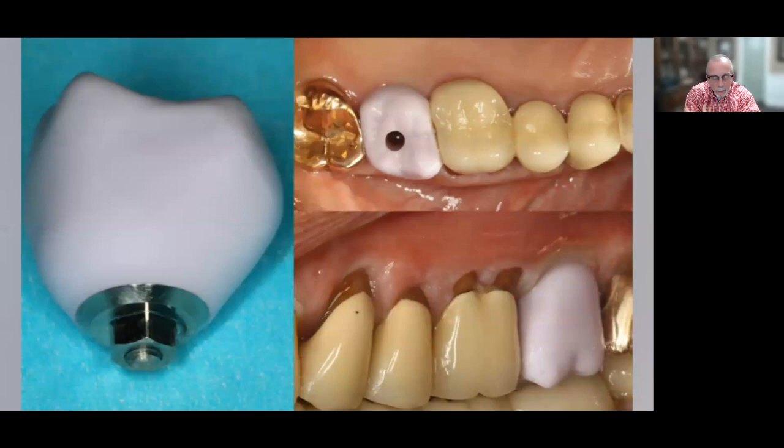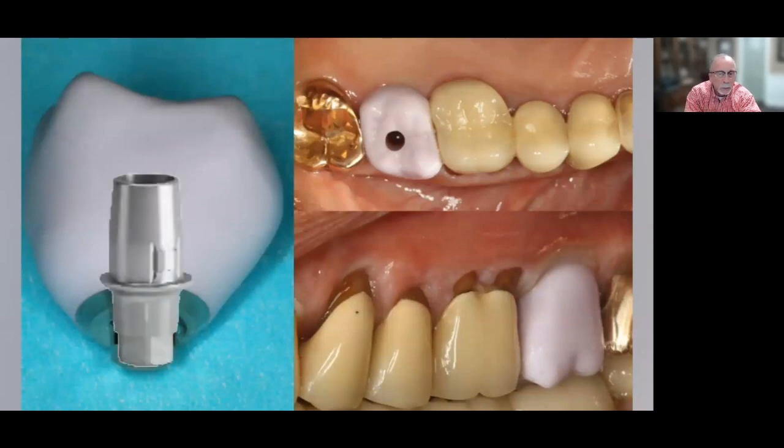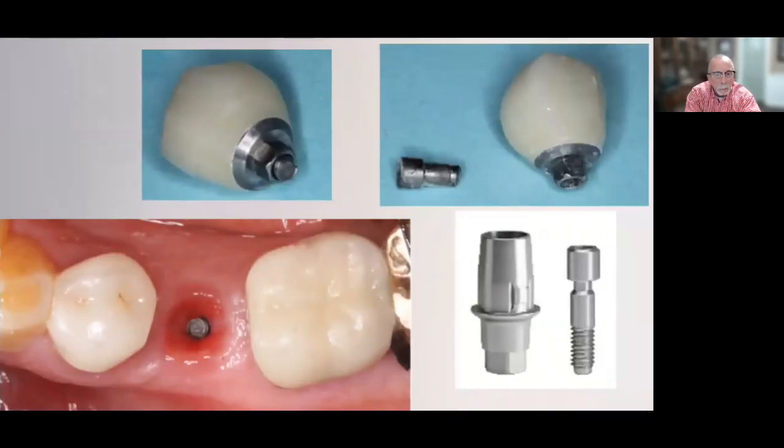And when I look back on it and I think about those little small, short, stubby parts and expecting them to hold the support for that crown, it's odd that we really thought these things would hold up. And again, it's not a fun day in a dental office when the screw breaks on a screw retained implant crown. But when you look at it from this perspective, you think it was kind of bold of us to consider that little screw system would hold up the mass of that molar crown. And I didn't have many do this. I'm not going to bash these things. They serve their place, but it can happen.